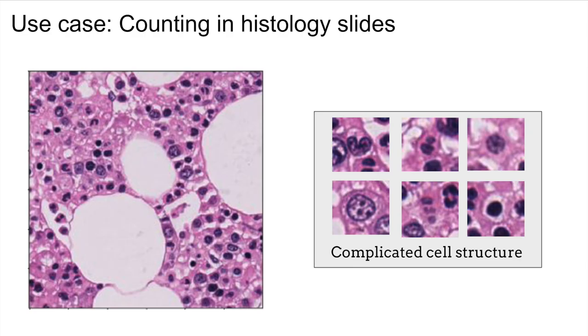Another use case is with histology slides. Here, identifying the cell nuclei is difficult because they can be viewed from different perspectives which cause the nuclei to vary in their appearance.